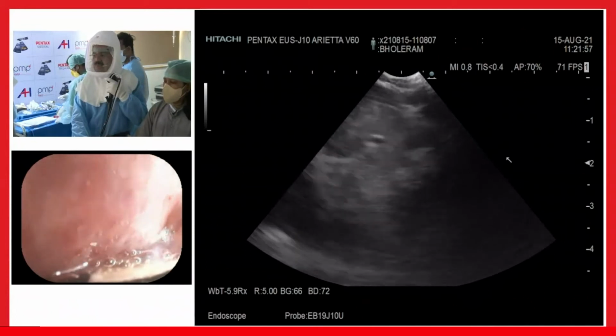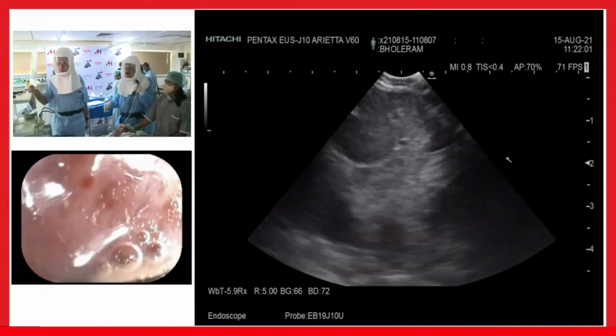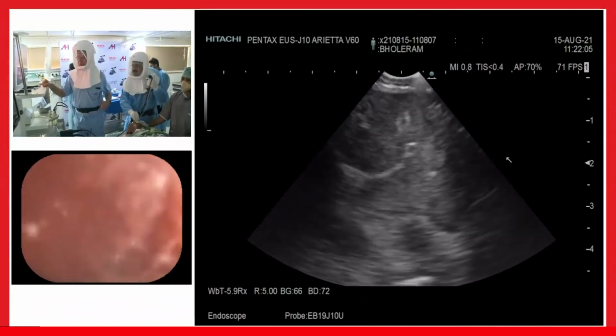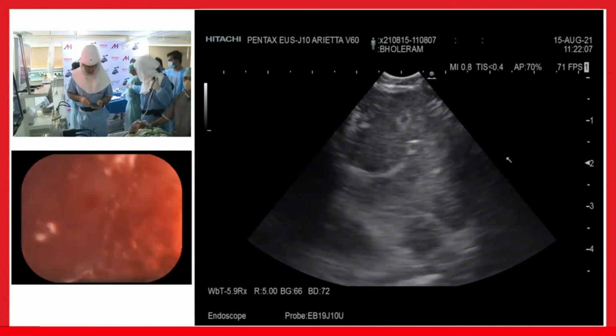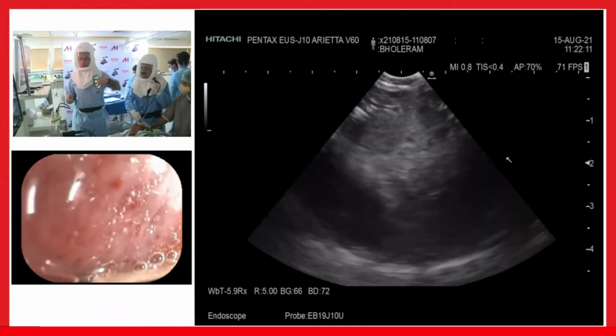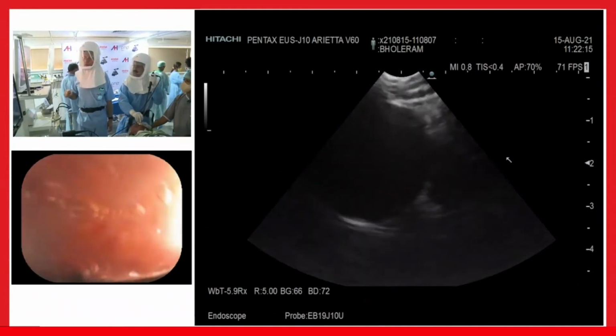So you have shown from the right bronchus. This is the left bronchus. Can you go into the right bronchus? Just okay. Because you've got 3 minutes left. You can do the FNAC later, but first show the audience. Because FNAC has already been shown, whatever you want to show.